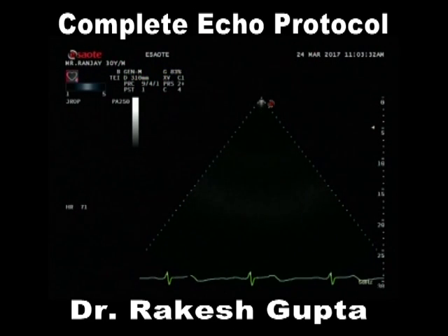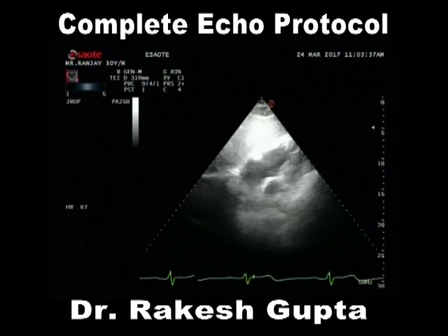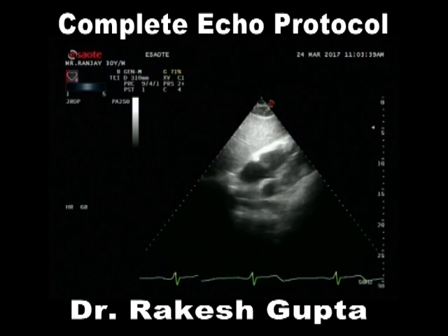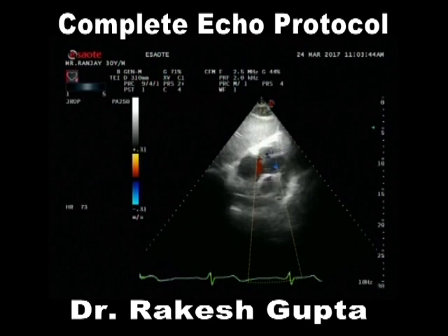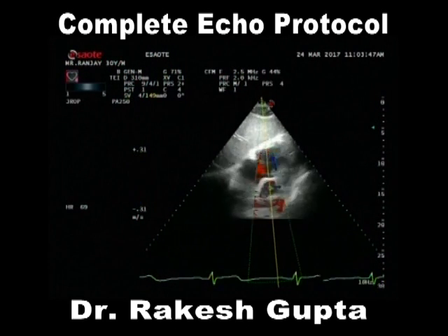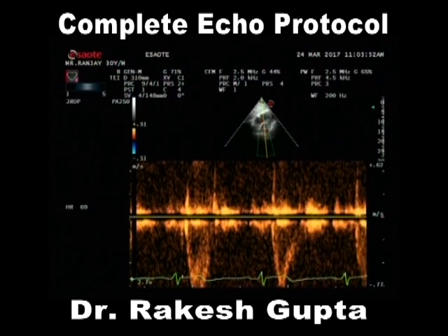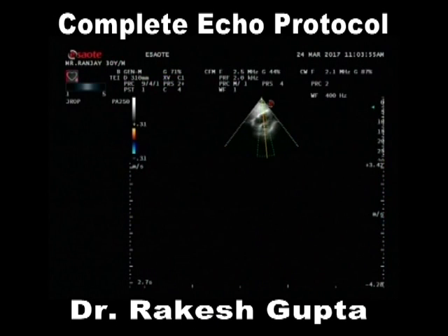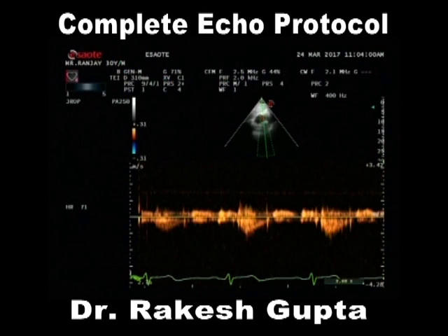Look, here I can see an aorta, one of the batch was demonstrating a very good aortic flow with a gradient of almost 6 meters per second. I can switch in and look at this. Can you see this aorta? And sometimes the jet is so eccentric that you get a maximum gradient in this particular subcostal window. And this is how we try to complete a complete echocardiographic study.